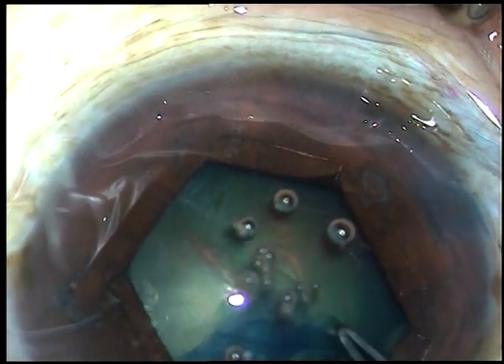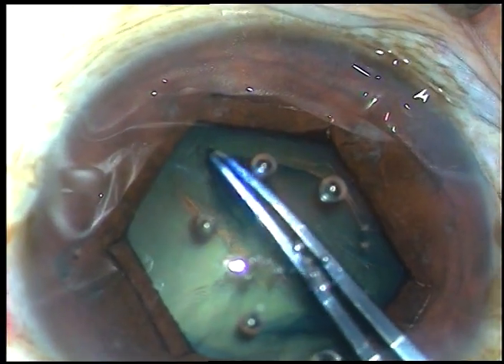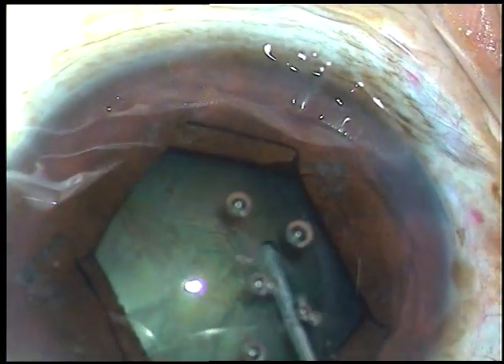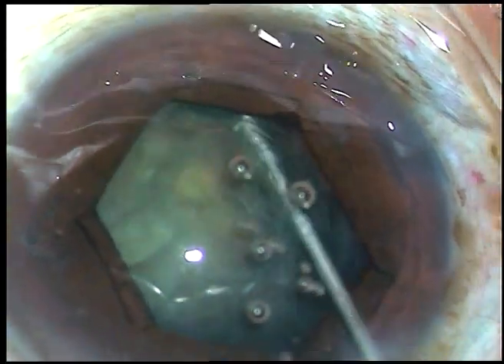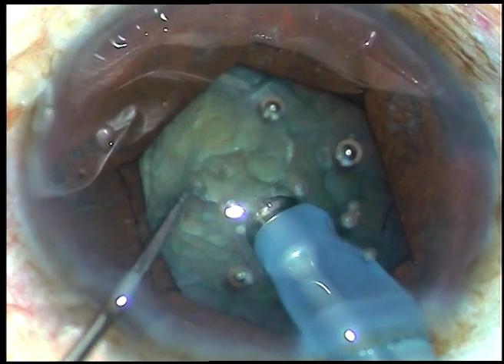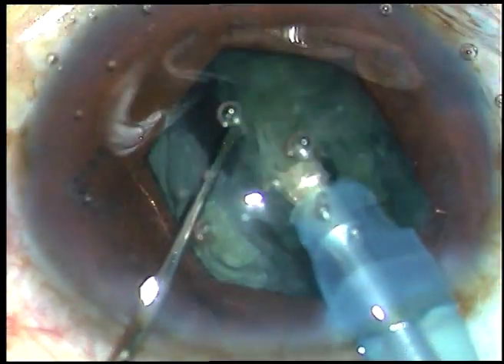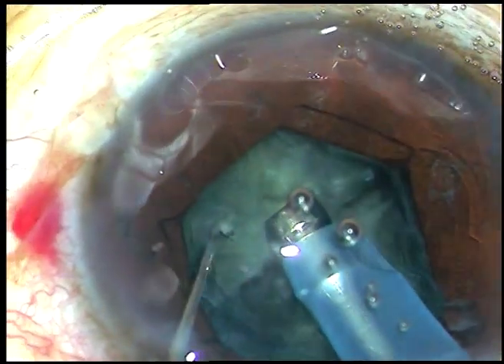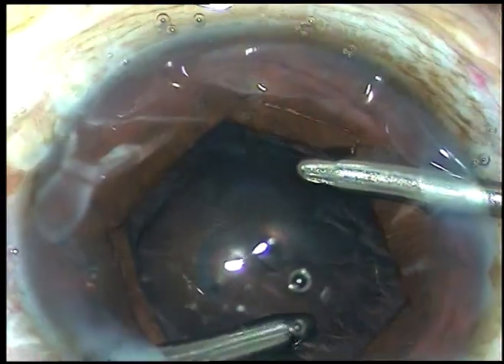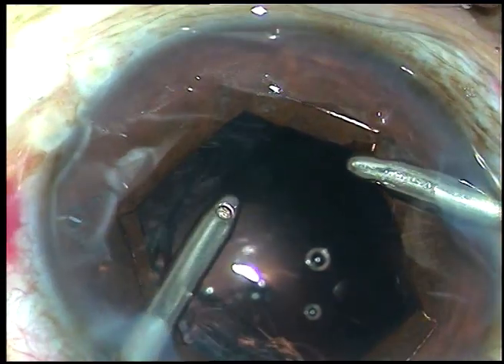So if the central part of the anterior capsule is injured, you can always manage. Now in this case I am going to show some more steps. Do hydrodissection — be very careful. Rotate the nucleus and then do direct vertical chop. Hold the nucleus firmly and chop it like this. Rotate the nucleus, hold it at another place, and chop this pre-nuclear fragment. Emulsify like this to manage the nucleus. Cortical cleanup can be very comfortably done by bimanual irrigation aspiration.